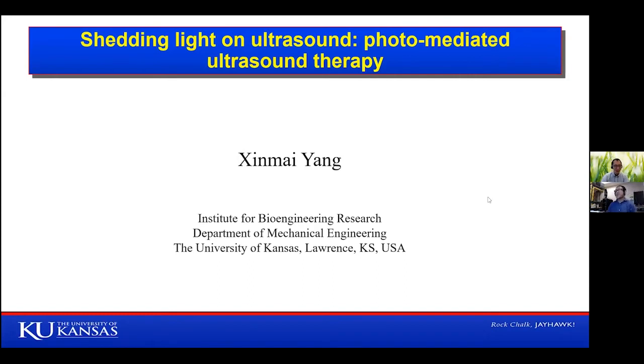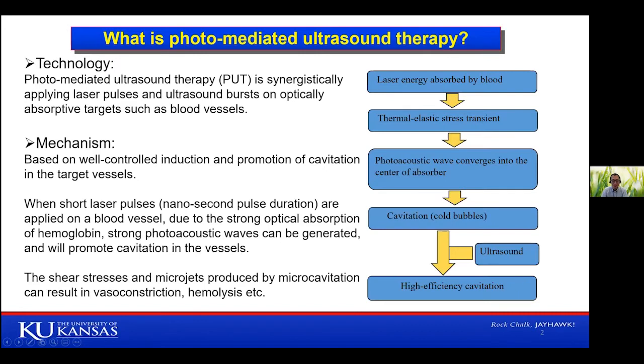So the topic is shedding light on ultrasound. Literally, we are shining light while operating the ultrasound signal. The technology we call photo-mediated ultrasound therapy. First, an introduction. What exactly is photo-mediated ultrasound therapy, which in short we call PUT? It's basically synergistically applying laser pulses and ultrasound bursts on optically absorptive targets, particularly such as blood vessels.